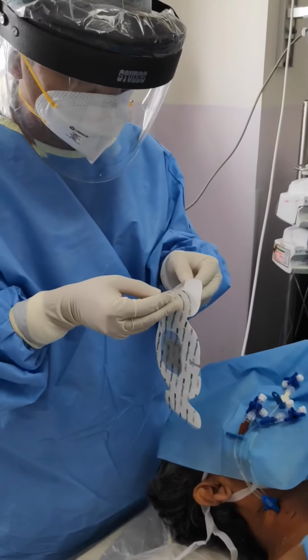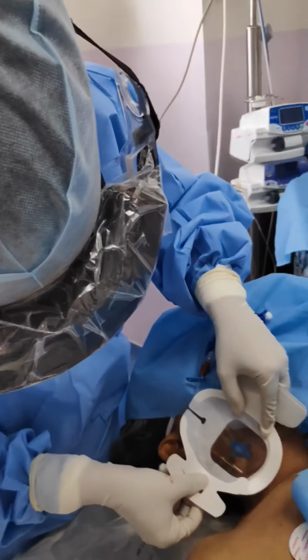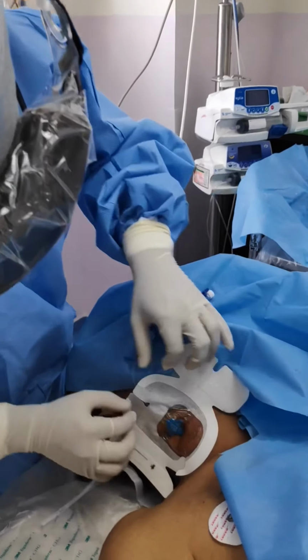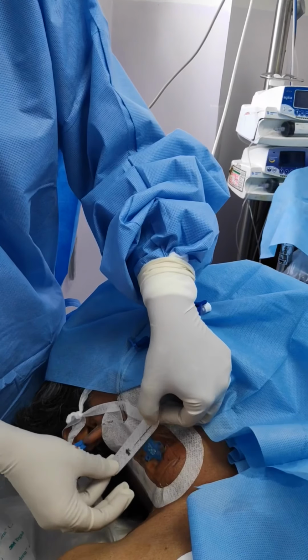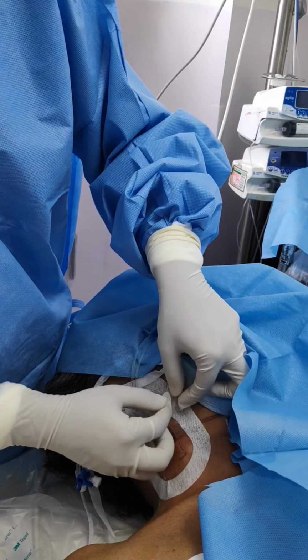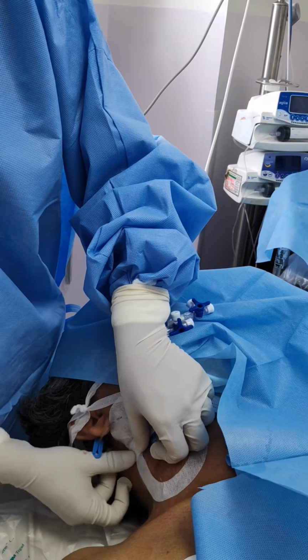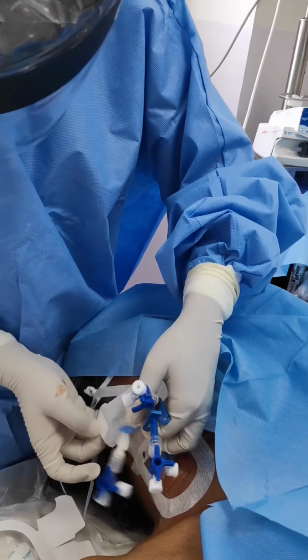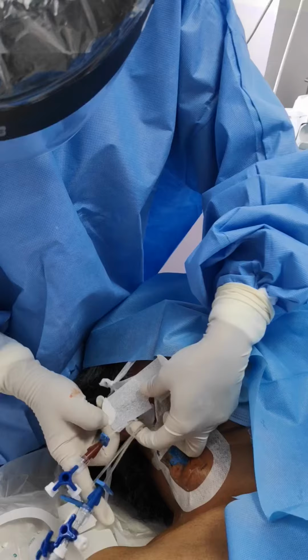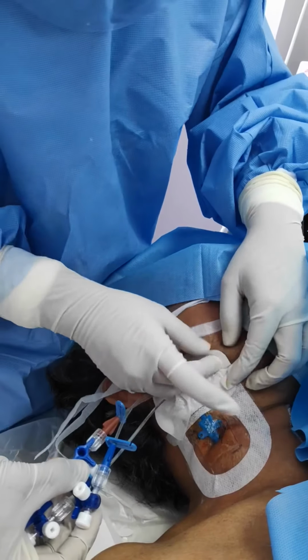This is an antiseptic dressing called tegaderm. The jelly-like thing which is on the inner surface of the dressing is coated with antibiotic, and it covers the insertion site directly so that there is decreased chances of any local infection. Dressing applied.